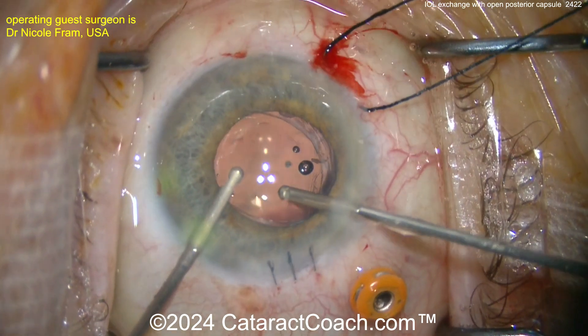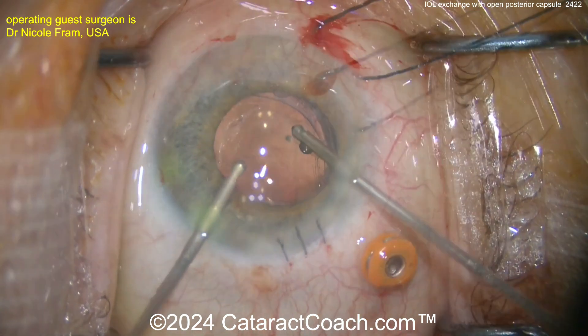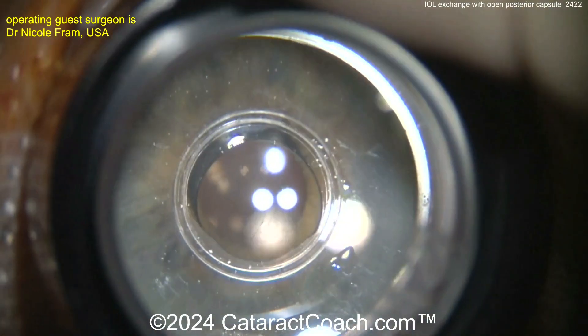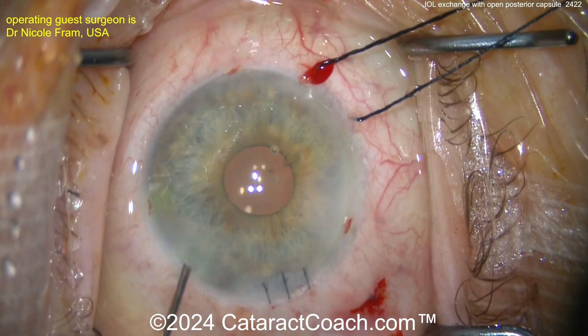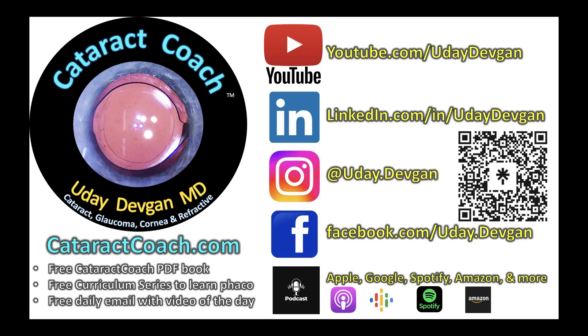Here at the end of the case you can see beautifully done viscoelastic removal, everything looks great. Check the IOP — pressure is good. Suture of the main incision, very nicely done. Let me tell you about the Cataract Coach podcast — the top podcast on all of ophthalmology. You are missing out by not listening. The sole purpose of the podcast is to make you more successful. Have it your way, but I told you so.